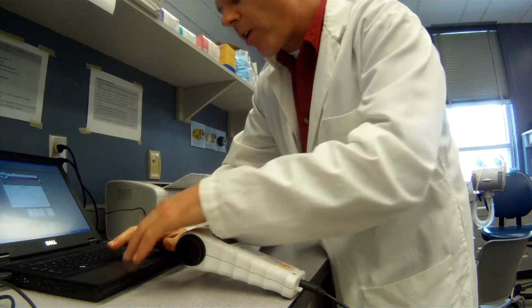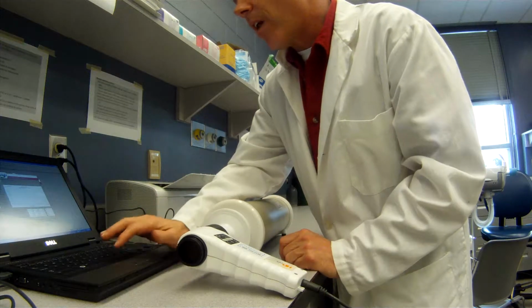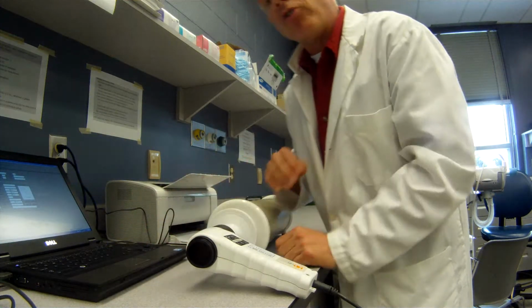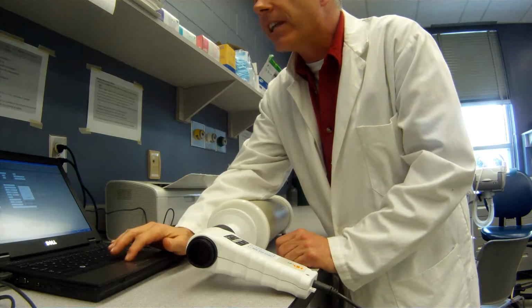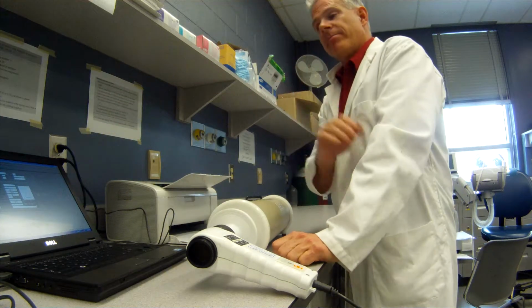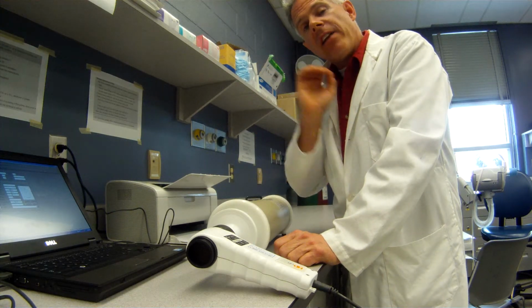Now there's one other little quirk about this device. When you go to do a slow vital capacity, and by the way, this will not ever get out of this until you hit close. All right? So you can print up this report, hit close, and now start putting in your patient data. One thing about this is for doing a slow vital capacity, for all your other tests you hit the go to, but for this particular one, you're going to go to lung volumes helium and then measure and then click on slow vital capacity test and do that through there.